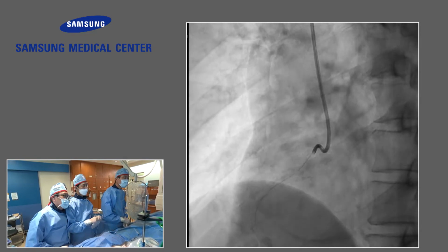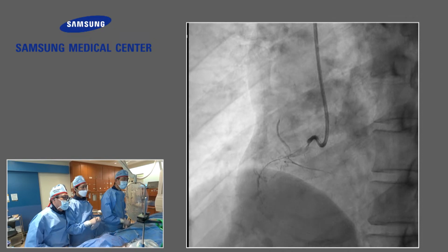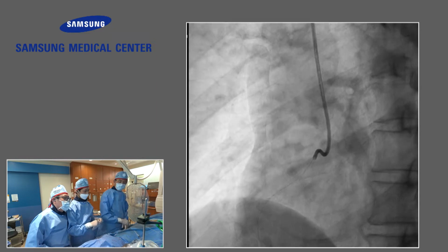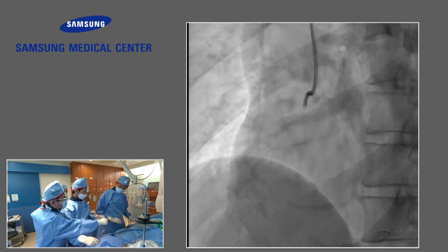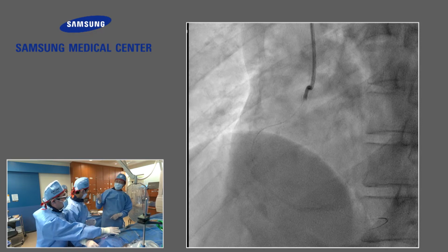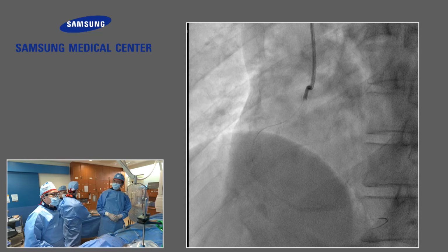It doesn't look like a bubble. We know that the balloon is not on the wire. The balloon is outside the guide wire, so you can retrieve it. So I need to remove all the guiding catheter together. No, just use another trap balloon. No, I don't like to take a risk. They recommend another trap balloon, but it can push the balloon out of the guiding catheter.